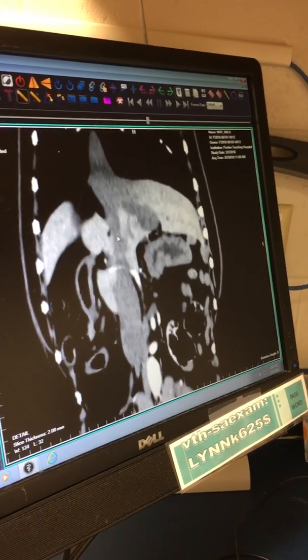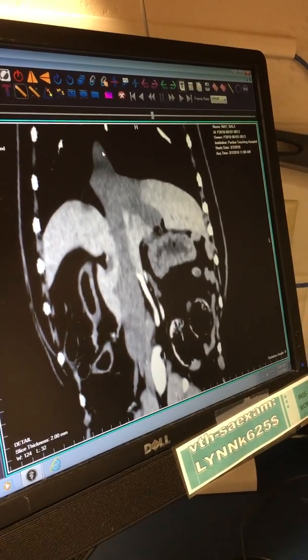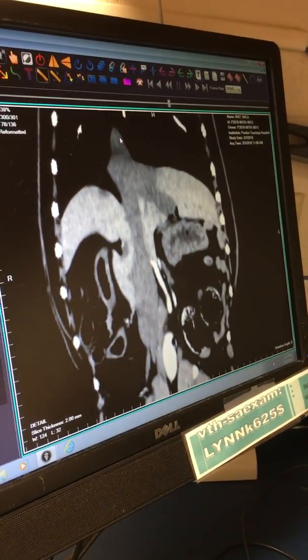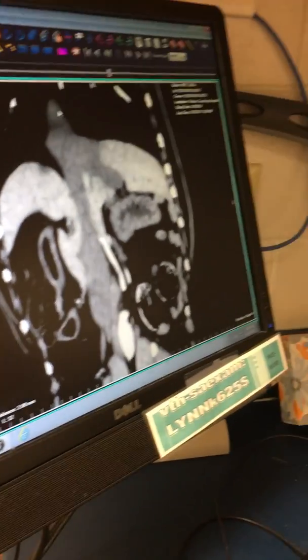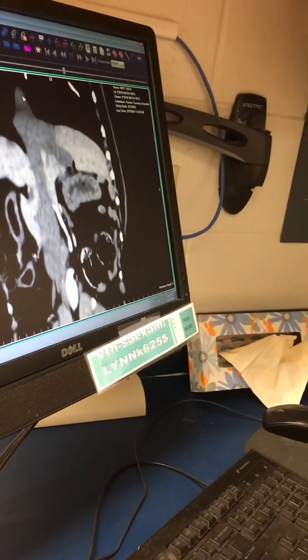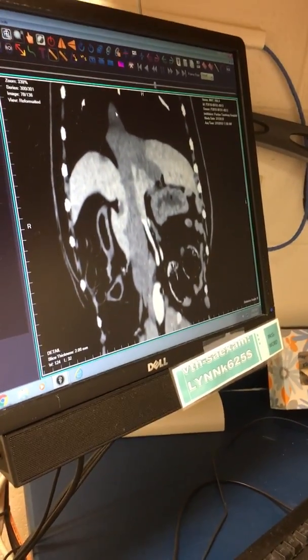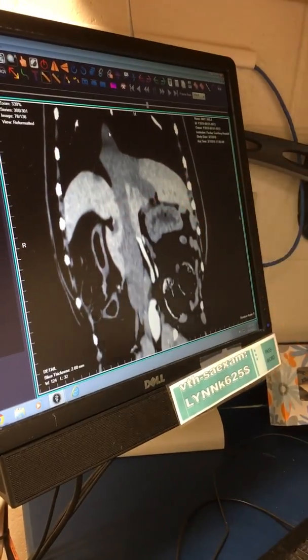So the idea will be to come in here. That shouldn't be too hard. You just come down the jugular vein and go into the caudal vena cava here, and we have catheters with little angles. We just kind of angle it to the left and a little bit dorsal, and it should go right in there. We have contrast. We'll inject to see where we are, and then we'll try to get the plug placed there.